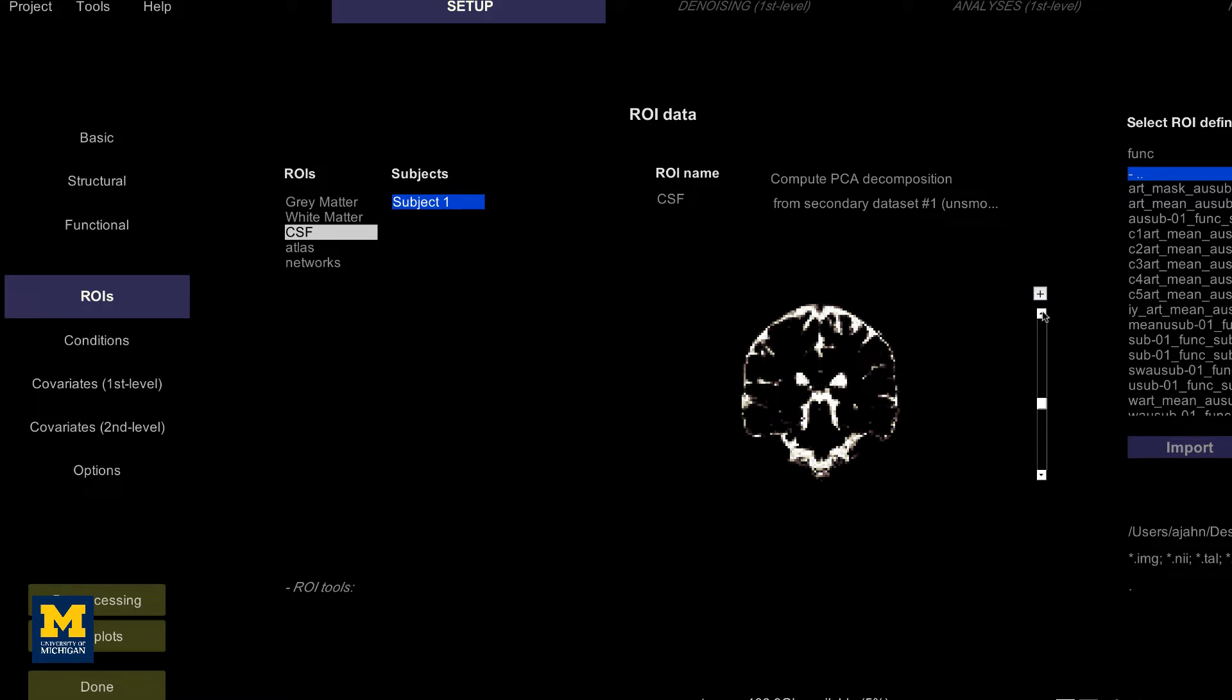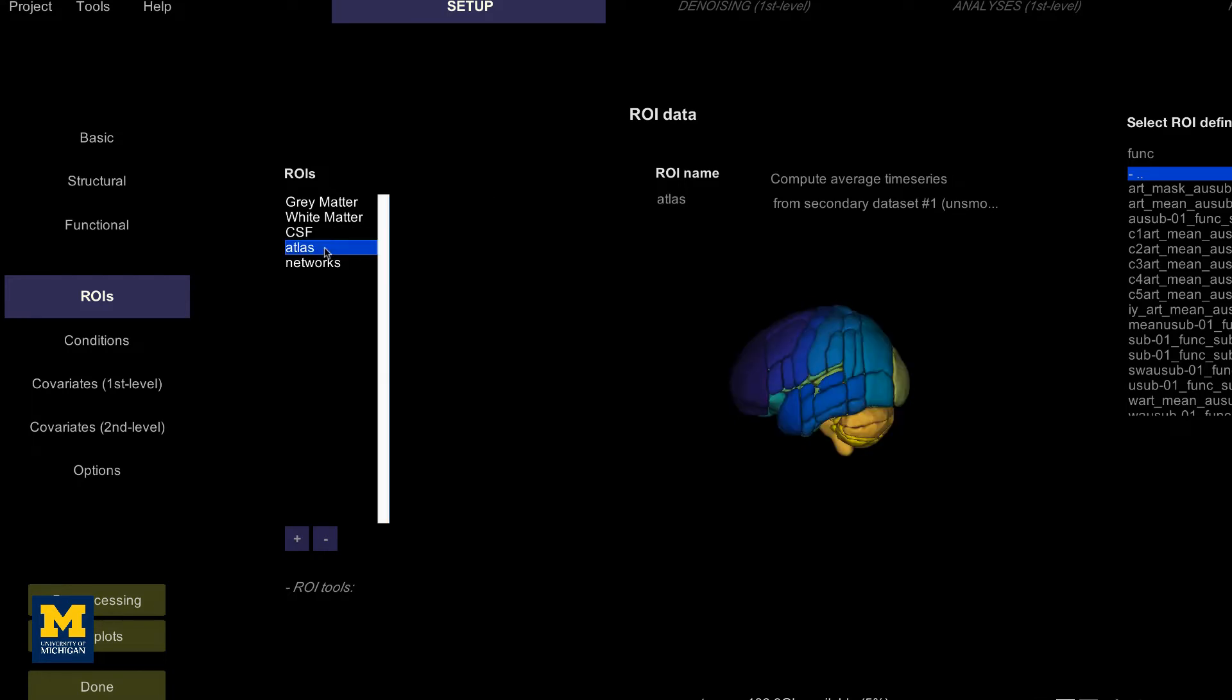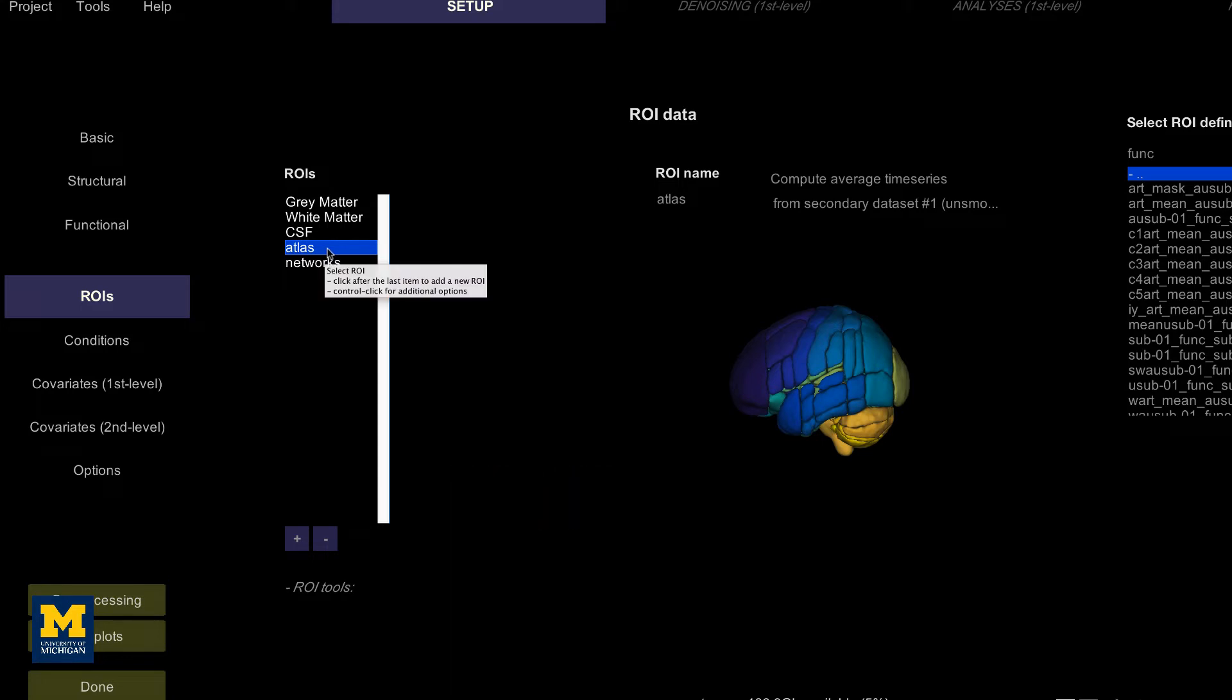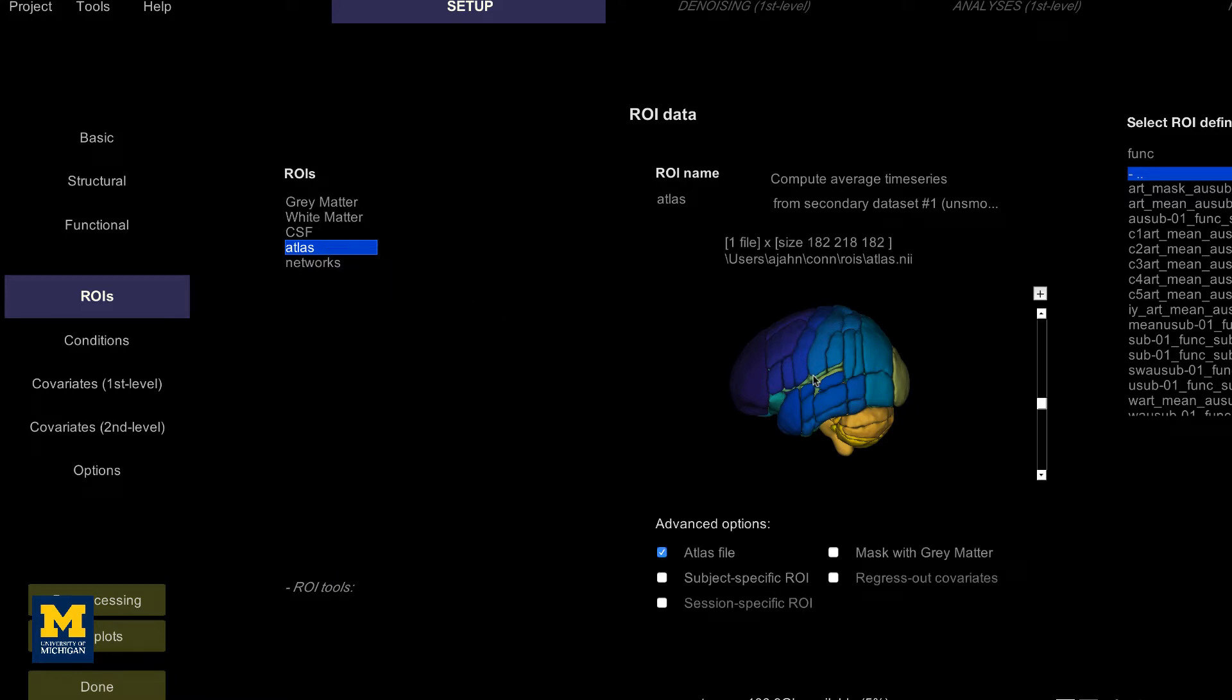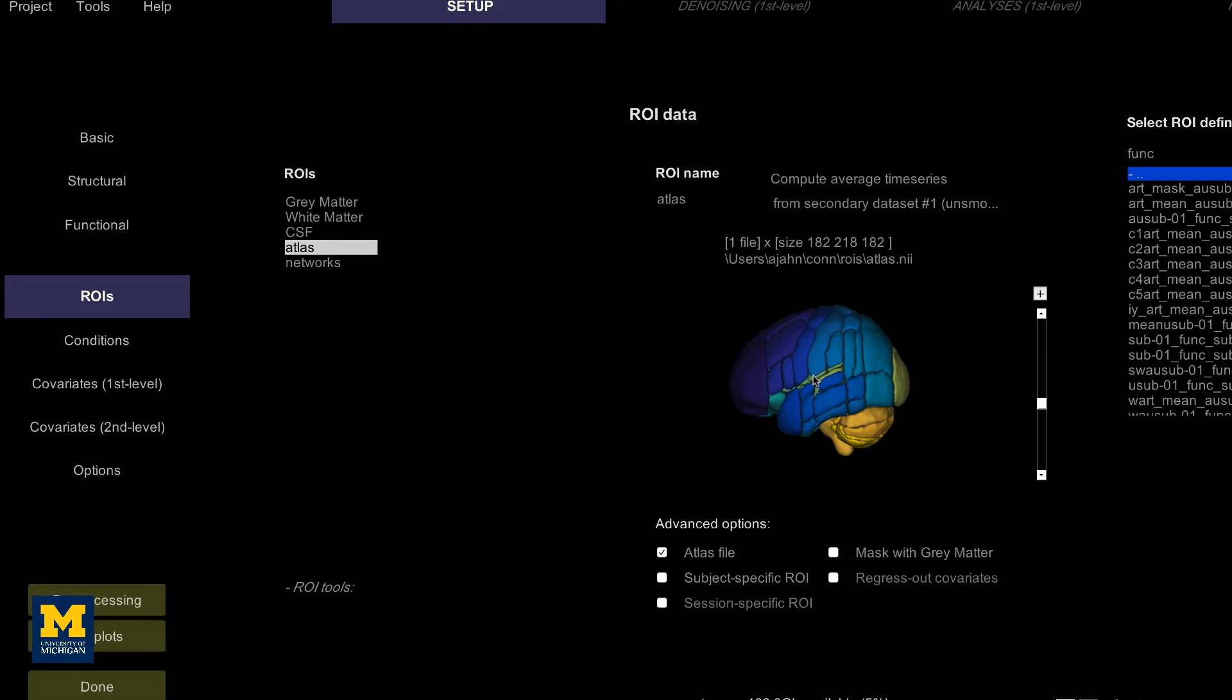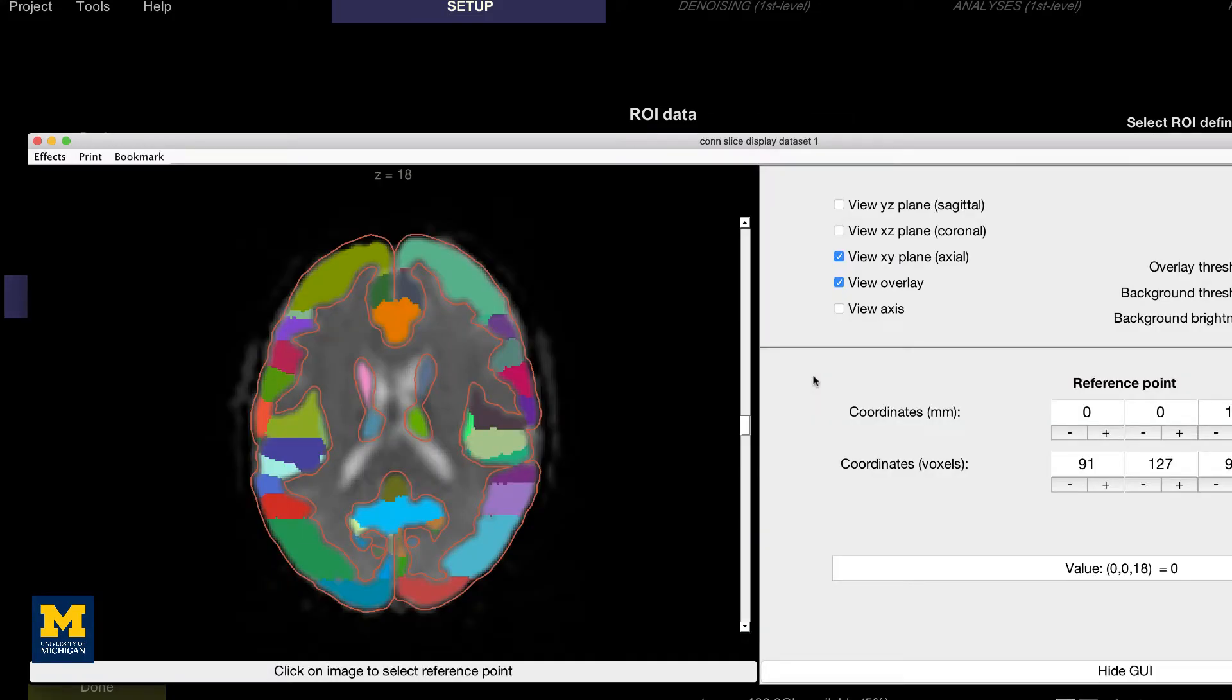The next output is atlases, or ways to parse the gray matter into different nodes. By default, the gray matter is partitioned according to the Harvard-Oxford Cortical Atlas and the cerebellum is partitioned according to the AAL Atlas. In order to see these atlases in more detail, clicking on the parcellated 3D brain will open a viewing window illustrating how the atlas has been resampled to the functional data.